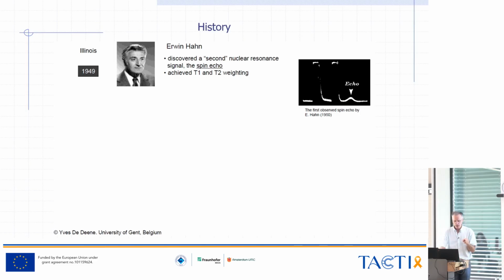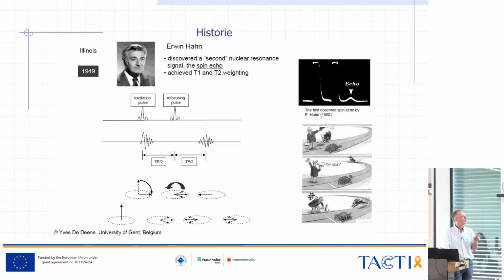And he came up with this quite nice cartoon with a racetrack where he says, consider this experiment like a race between two different runners, which is really an unfair comparison, because one is really quick and the other one is really slow.